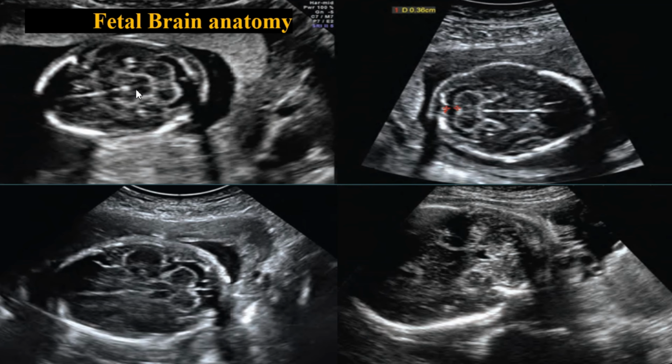And now here we can see the axial image of the head which is tilted inferiorly toward the occipital, and it depicts the cerebellum here, and these are composed of two rounded hemispheres and the vermis in the midline. And here we can see the measurement of the cisterna magna.